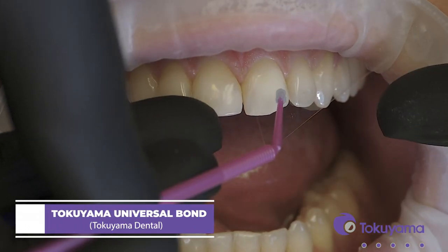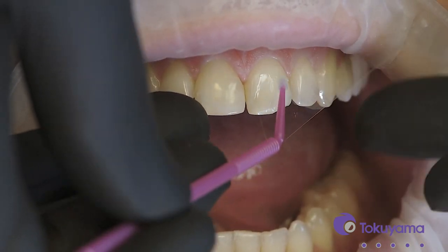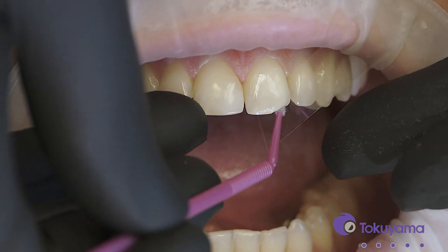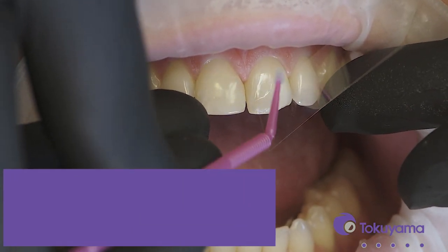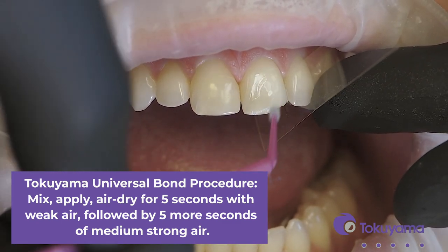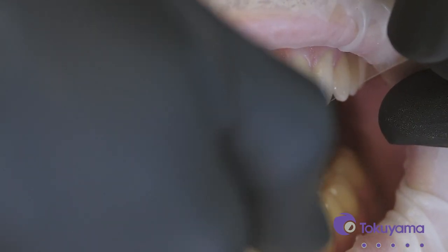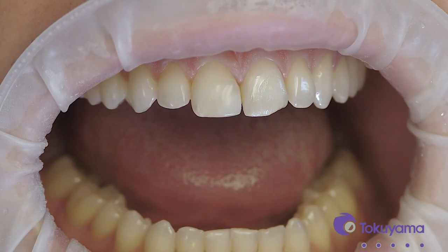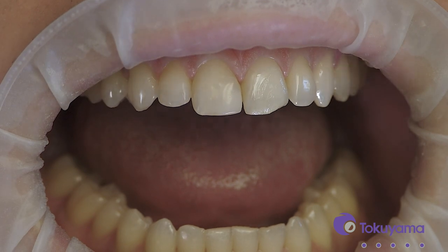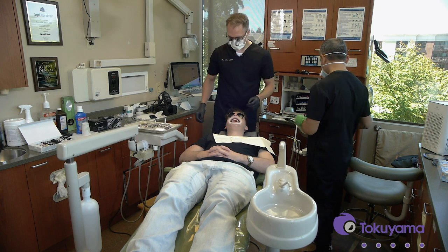This stuff is awesome — it's a wonderful bonding resin because it is truly universal; it'll work on any material. One of the advantages I like about it is you don't have to worry about scrubbing it in for 15 or 20 seconds, and you don't have to light cure it. That simplifies the process, and when you're using it on posterior teeth and deep interproximal boxes, you don't have to worry that the light's not reaching it.